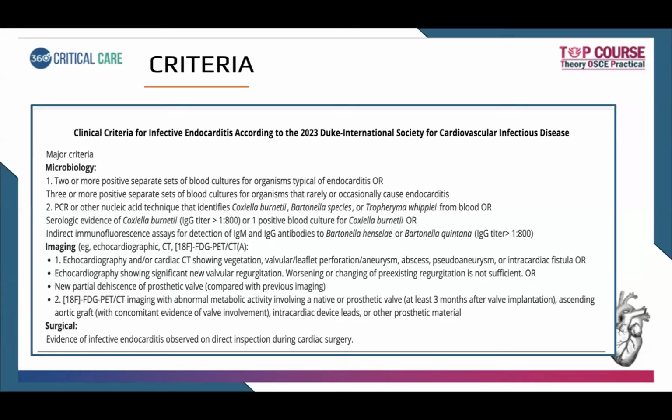TEE, if TTE is not diagnostic in patients in whom infective endocarditis is suspected, then you do a TEE. But if complications are suspected, like a new murmur, embolism, persisting fever, heart failure, abscess, AV block, then you do a TEE. But repeat TEE when you have to do. As per AHA, it should be 3 to 5 days later after the treatment, and as per European guidelines, it is usually 7 to 10 days after the primary TEE.